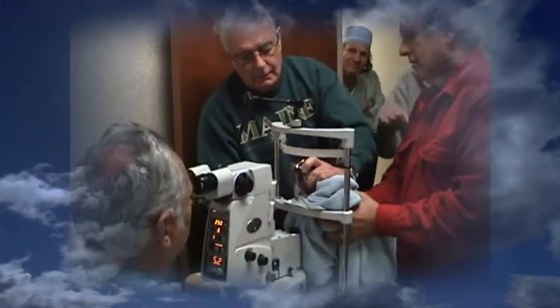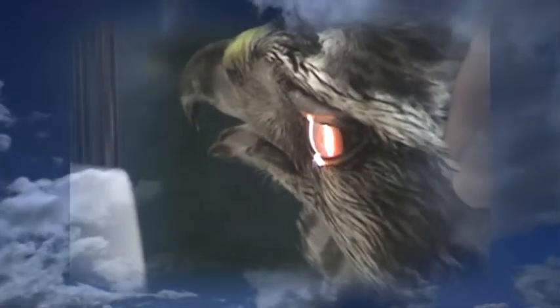Now, both me and Dr. Ehrlich, the two of us, were here that day, and we used a laser to use the energy to break up that film in the eye. People, you and I, have 2 eyelids. Birds have 3. Not only is there the upper lid and lower lid, but there's also one near the nose that flicks outwards to keep the eye clean.